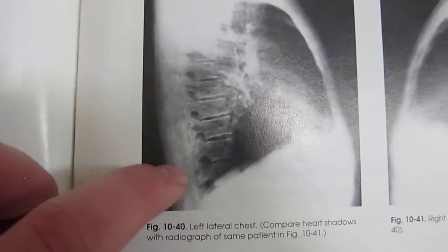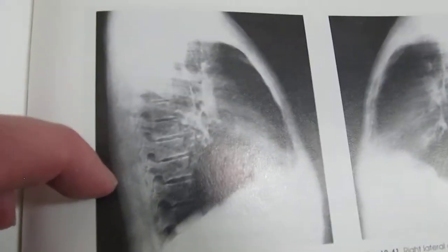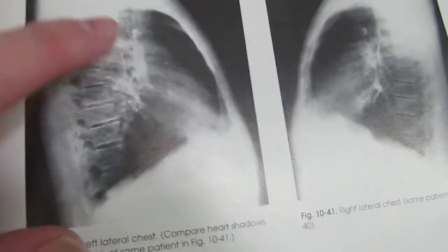And my lateral, which is the second x-ray I took, also looks pretty nice. We see the posterior ribs, the ribs posterior to the spine, not much rotation. We have all the anatomy, and intervertebral disc spaces are open. We see the shadow of the heart, the hilar, the hilum, and everything looks good.